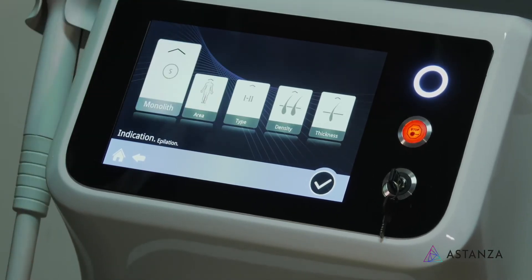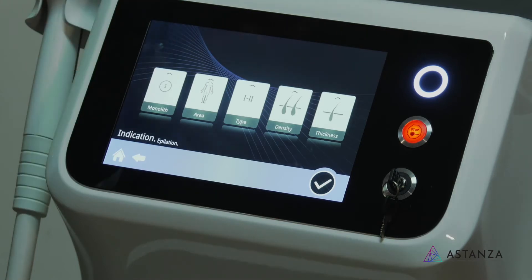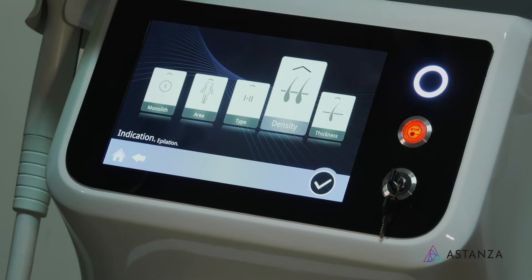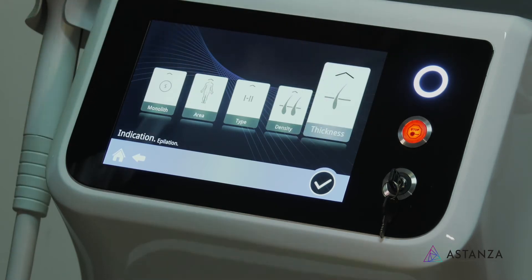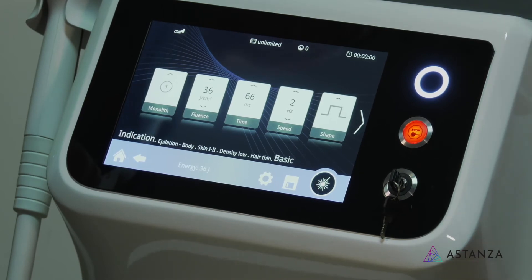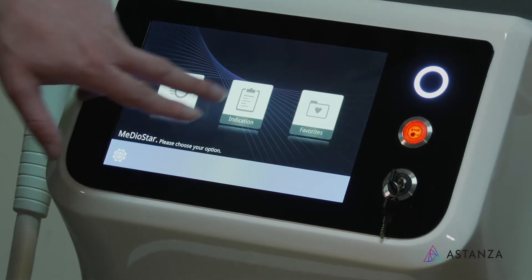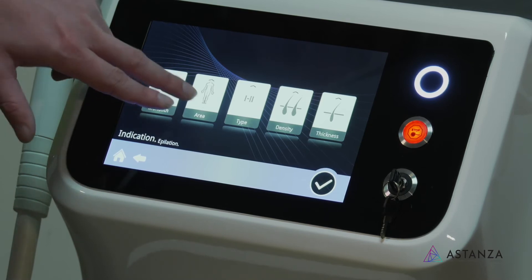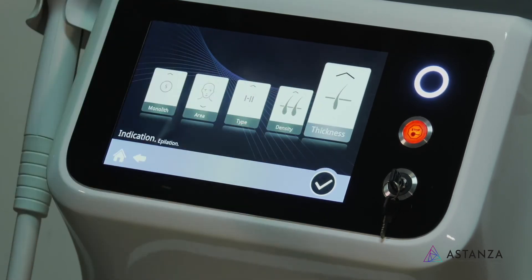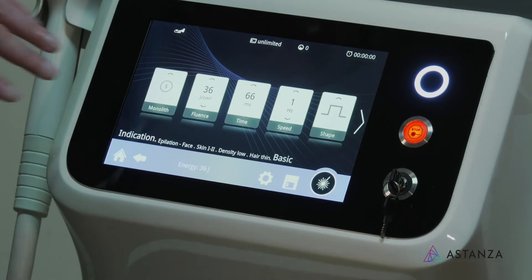Let's say we're doing face — I want to use a smaller handpiece. We're doing those unfortunate chin hairs in skin type two. Density is fine, thickness is probably going to be pretty thin, and then we can go ahead. And then thickness on the body — thick two — and we're ready to go. You can see that there are a lot more joules in a lot shorter time frame.